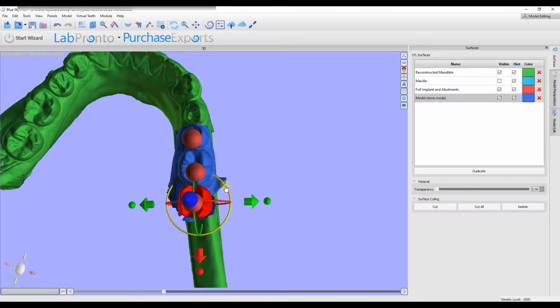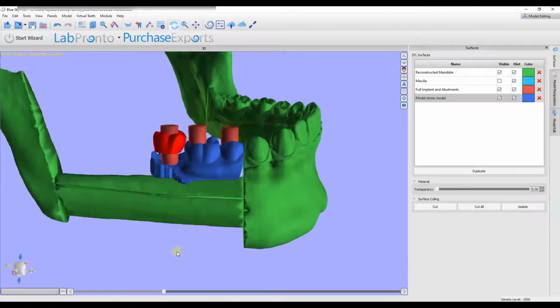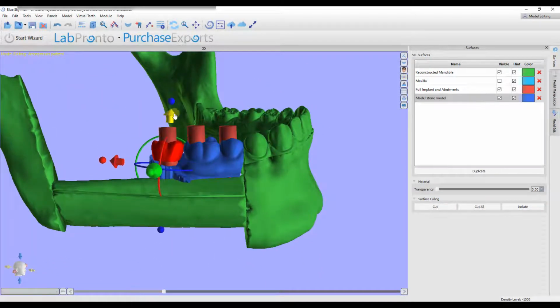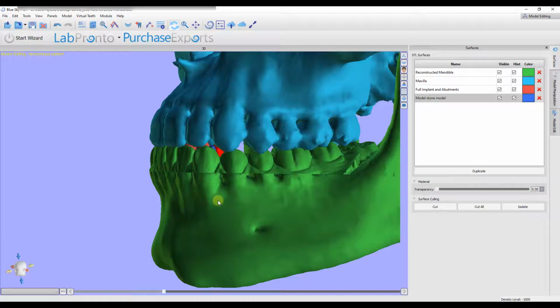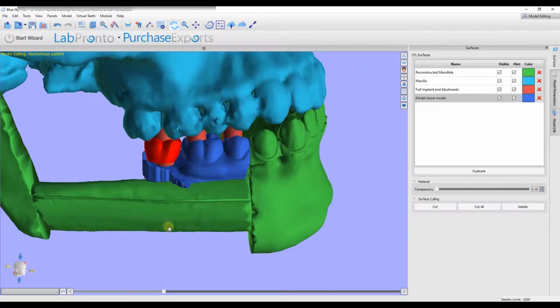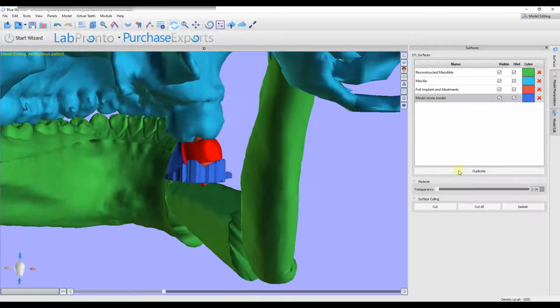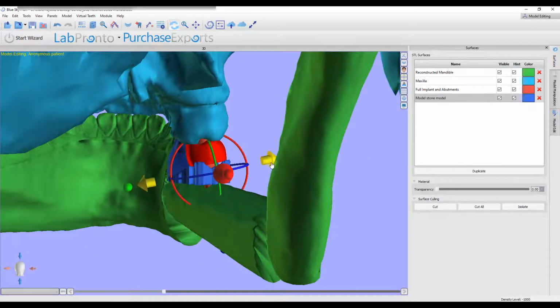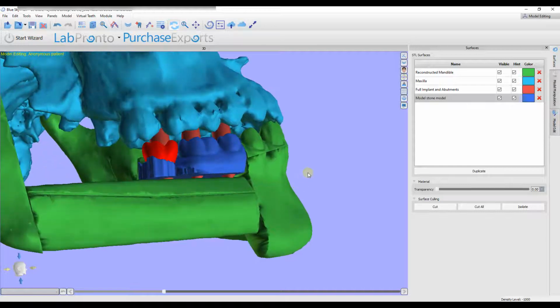And we've got the upper teeth here in this skull model. And the occlusion here is actually, on this patient, it's a little strange because this was verified in the mouth. He has a kind of a malocclusion to begin with. And so what I'm looking at here is I just want to make sure it's in rough alignment with how it should be with the top teeth there.